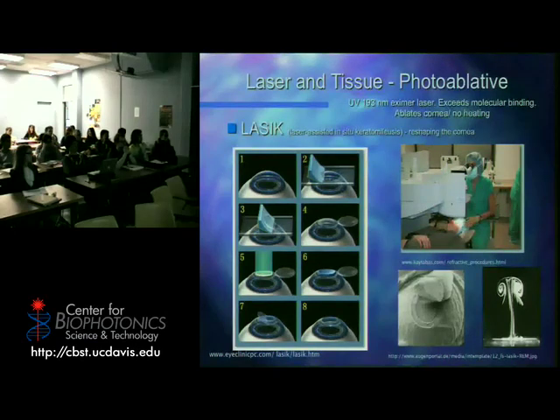So this is showing you on a cow eye the flap removed and the shaping of the cornea. You see how it goes in? That's been shaped. And then they would put the flap back on. And this is like a sideways view showing you what the laser pulse hits. This is the effective vaporization of a layer of cells. This is the little mushroom cloud from the vaporization of the layer of cells, okay? That's ablation. Ablation, you've just gone poof, and basically the molecule's been torn apart. Okay? That's the important thing about photoablation.